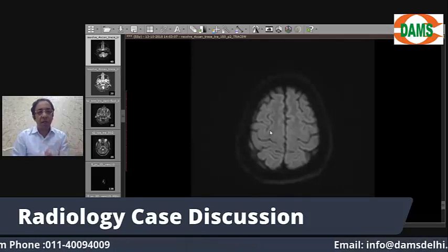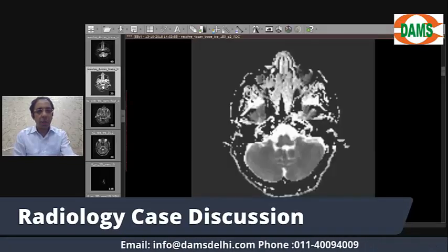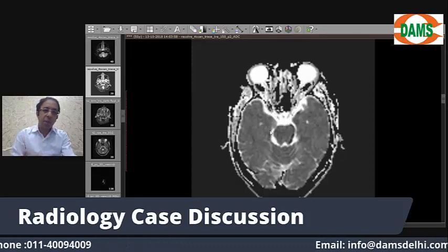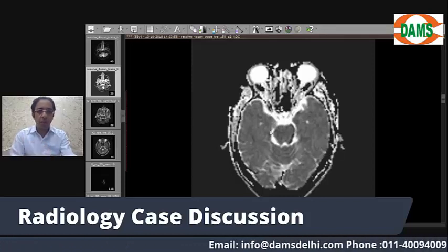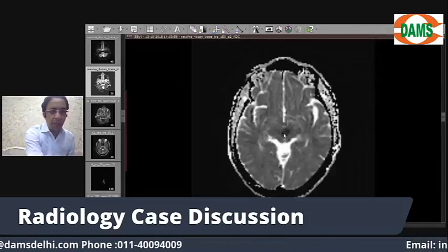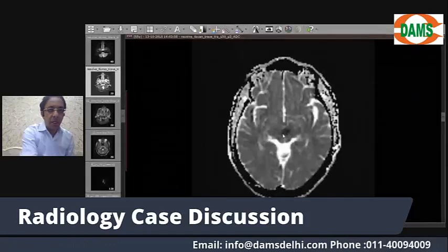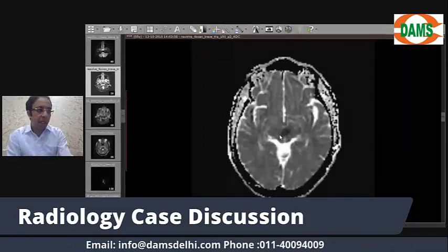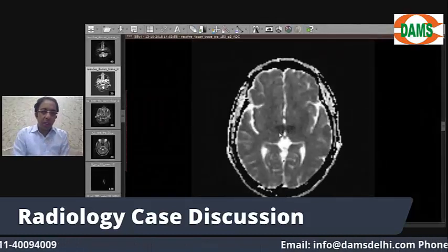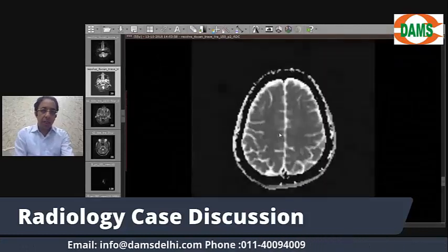We would also like to confirm the infarction by looking at the ADC map — ADC stands for apparent diffusion coefficient. An acute infarct should appear dark on the ADC image. Tracing the same area where we saw the hyperintense signal on DWI, we can see hypointense signal in the ADC map in the rostral midbrain and bilateral paramedian thalamic areas, confirming we are dealing with acute infarction in this territory.